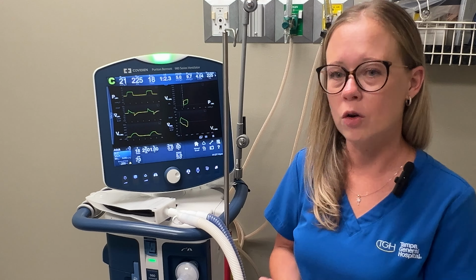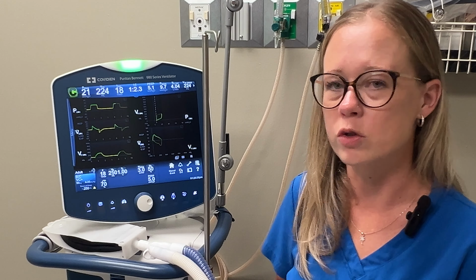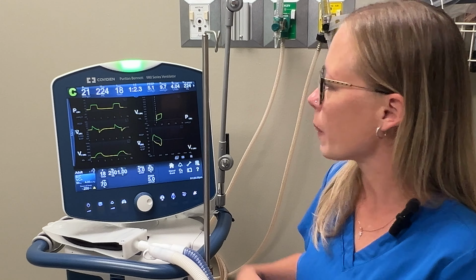And you can also tell because the frequency here that we have set is 18. So if the rate here were over 18, you would know the patient is initiating those breaths. If you were to see an S up here in the corner, that's a spontaneous mode. That means we're doing an SBT, we're seeing how the patients can do on their own before extubation.